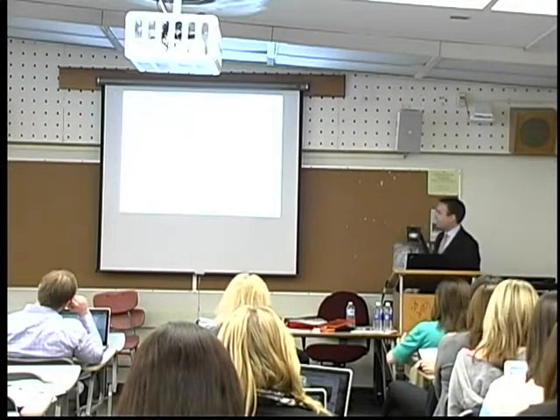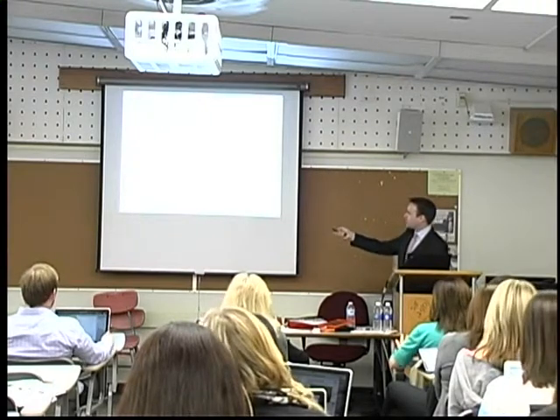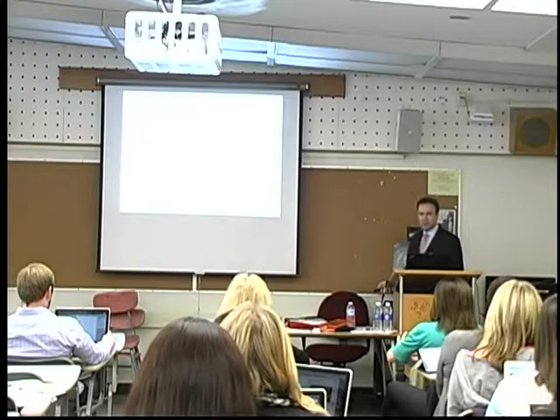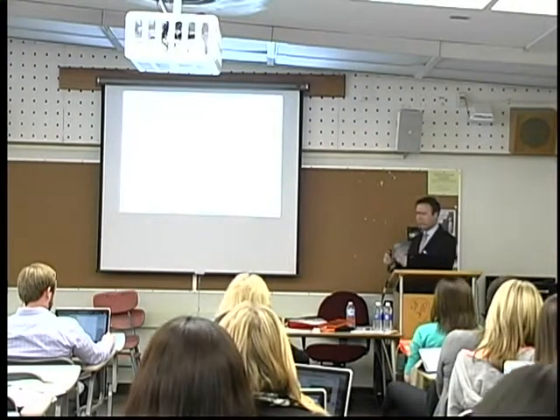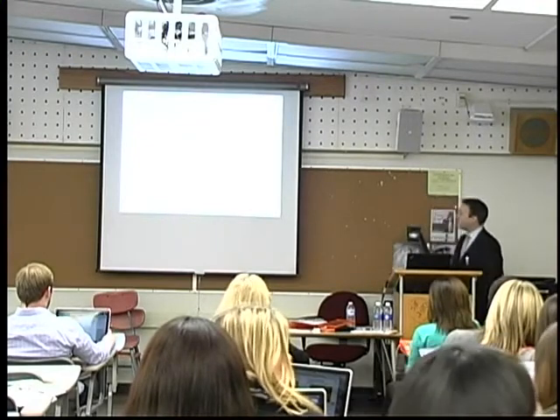Speak One is something that I already mentioned that is out there as a prototype and an early simple app that you can use to test cause and effect, tablet candidacy, kind of try out how big should the symbols be, what is an ideal size for someone who is just starting with iPad intervention.